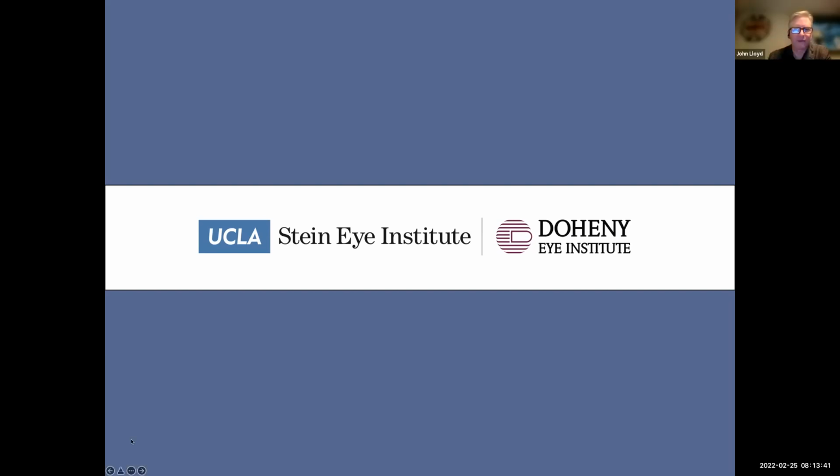Thank you very much, Dr. Saraf. We have a few questions, and I'm going to lead off with one showing my ignorance since I do cataract refractive. But you showed several slides where the fluid could be from RPE pump failure in the drusenoid PEDs. And had you treated those patients with anti-VEGF injections, they might have just spontaneously resolved anyway, and you would therefore have thought that your treatment had actually worked. So I just wondered if you could comment on that. Presumably, you must need some angiographic evidence before you begin treatment then.